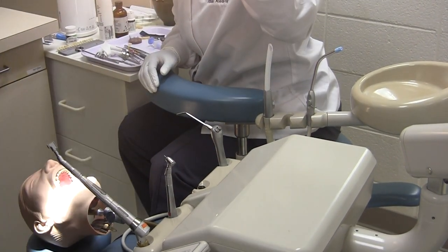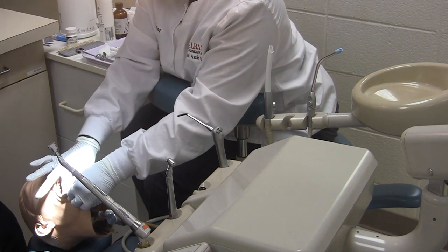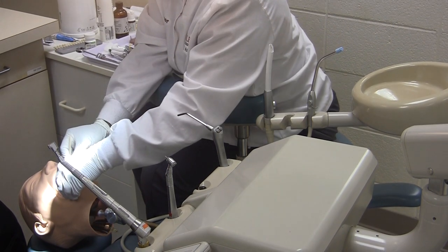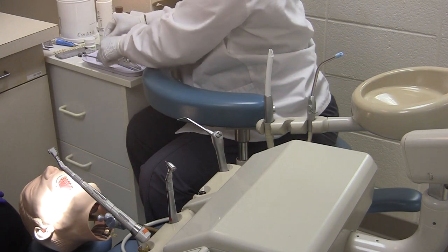This is a crown and bridge procedure on tooth number 30. The assistant will place topical anesthetic for one to two minutes, and after one to two minutes has passed, pass the anesthetic syringe.